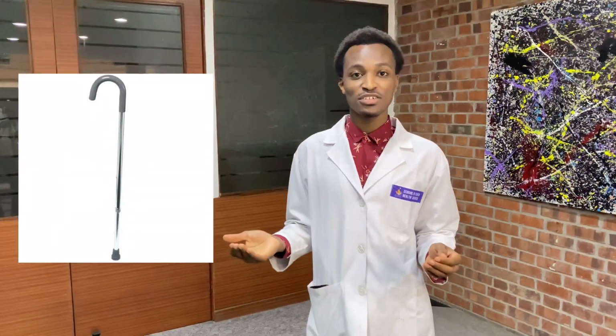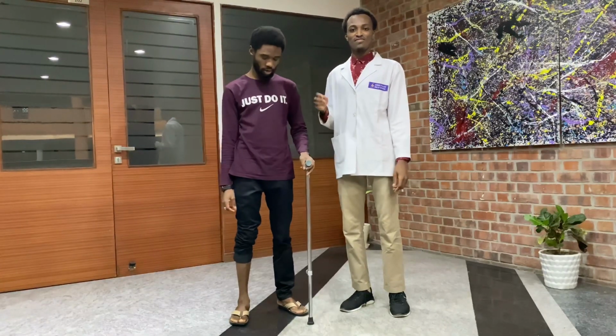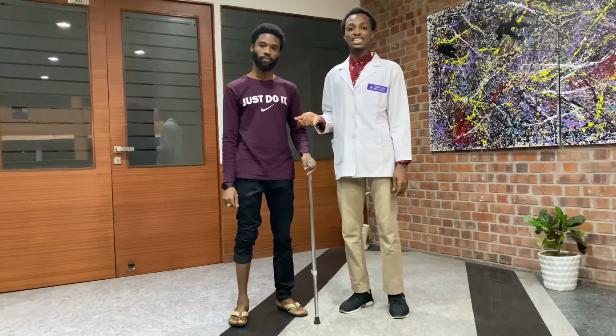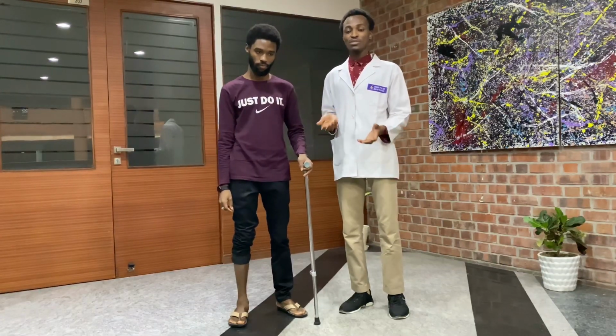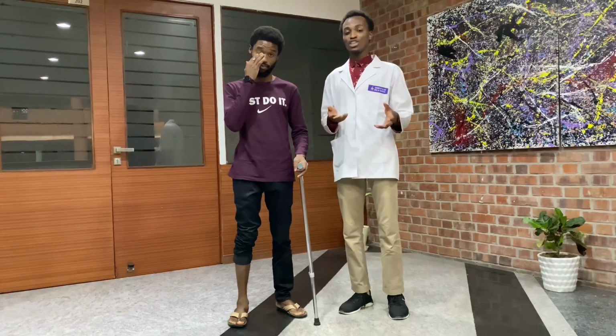Types of walking aid: cane, walker, and crutches. Features of cane: most common mobility aid, and it is commonly made of wood or aluminium. It transmits 20 to 25% of body weight.